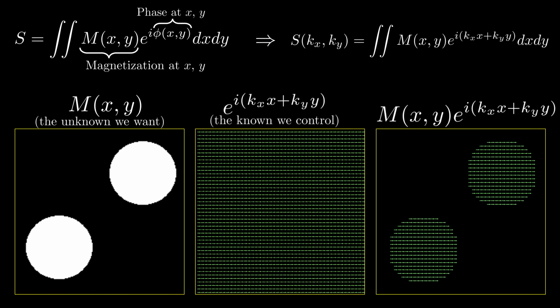If you're clever, you can design your pulse sequence to tease these dependencies apart and produce images which reflect the effects, such as fluid flow or physiologic activity. And yes, I do want to make videos about all of those at some point, but that's going to have to wait till later. Okay.